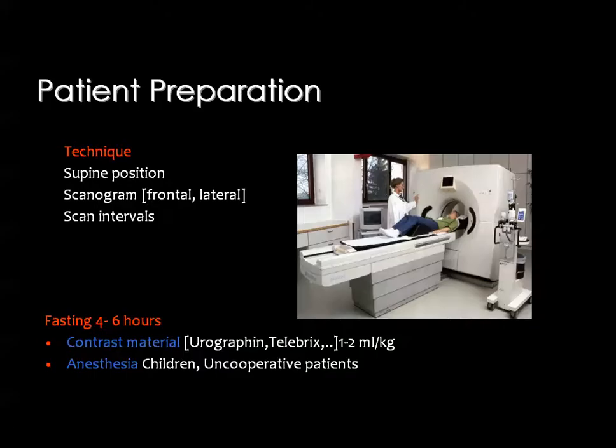Then we came to the CT scan, and CT is considered one of the valuable modalities for evaluation of the spine at a time before the era of MRI, and now its role has regressed a little bit as a primary imaging for the spine.